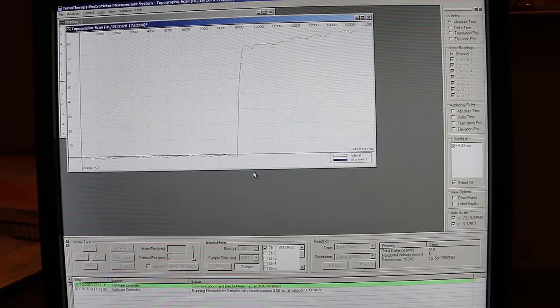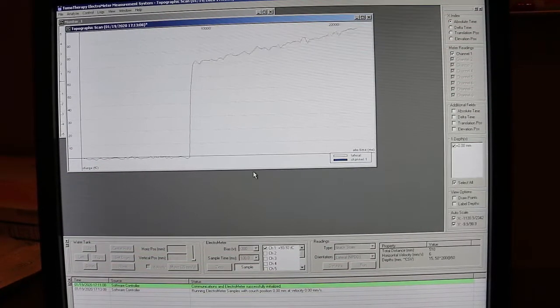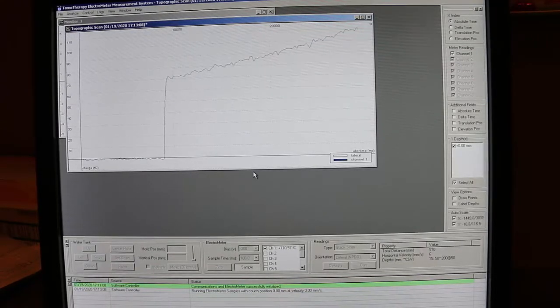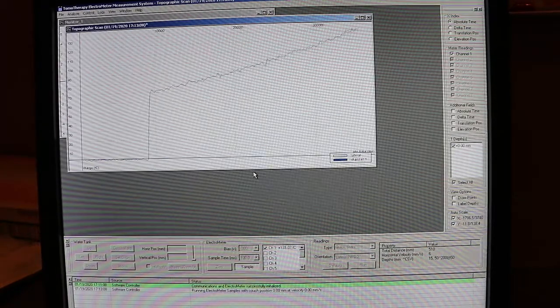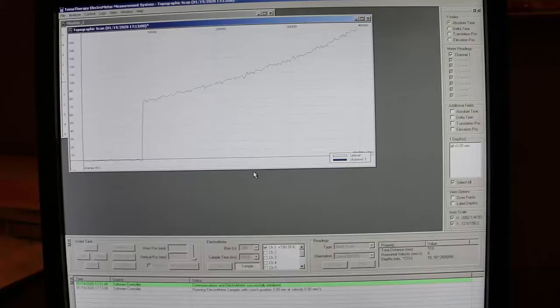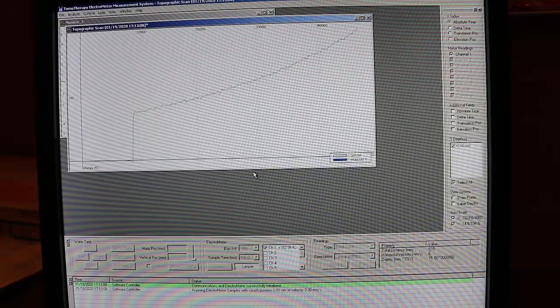And so you'll see what looks like a big jump when the MLC leaves actually open. But this one profile, I think I'm just going to let run all the way out, because it is pretty cool to watch this thing start to ramp up faster and faster as the chamber actually moves into the field. You can skip to 626 when the profile finishes measuring if you don't want to watch that.